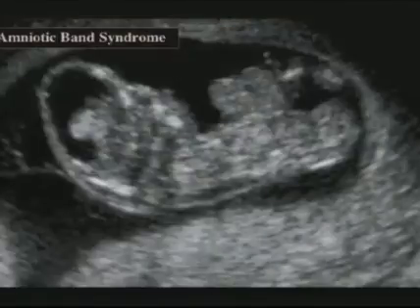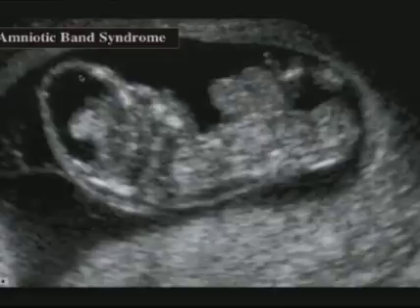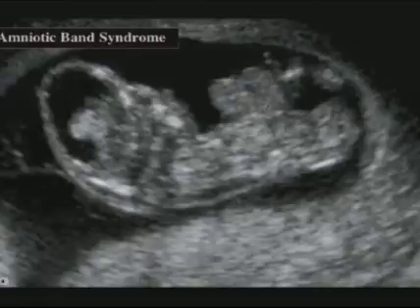This is a fetus that has amniotic band syndrome. This fetus was about 11 weeks, and you can see that there are a lot of abnormalities here. There is a large encephalocele here. There is a large anterior abdominal wall defect right here. You can actually see the bands right in here and in there.